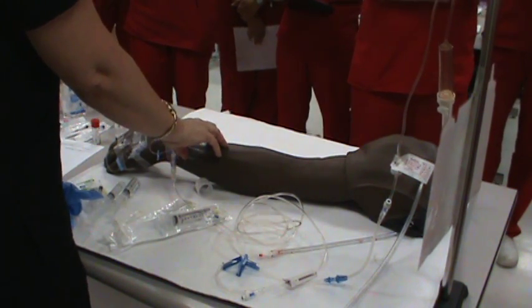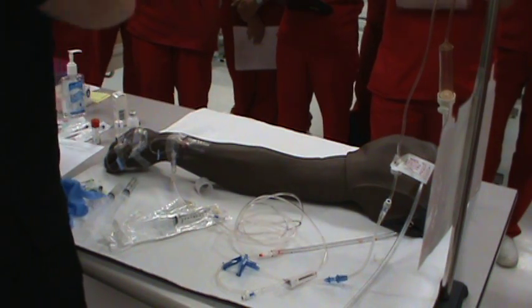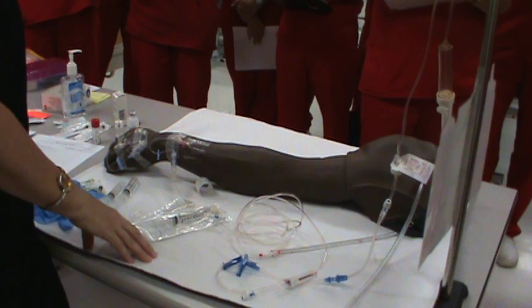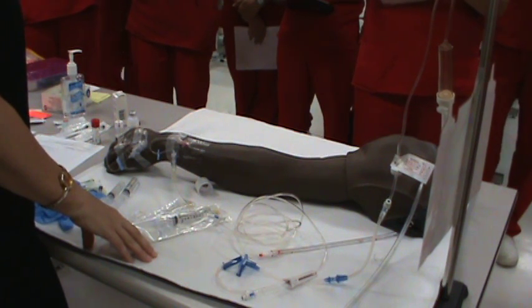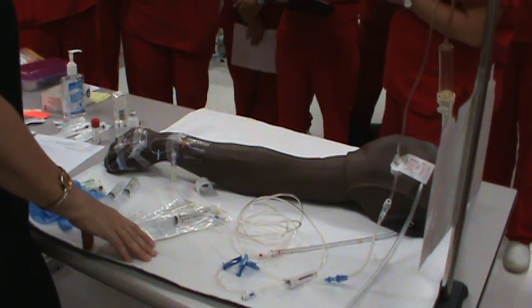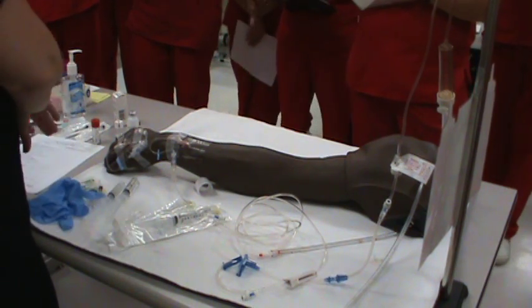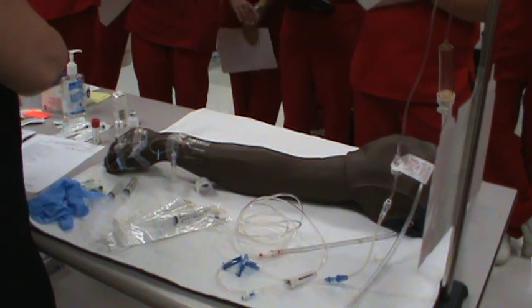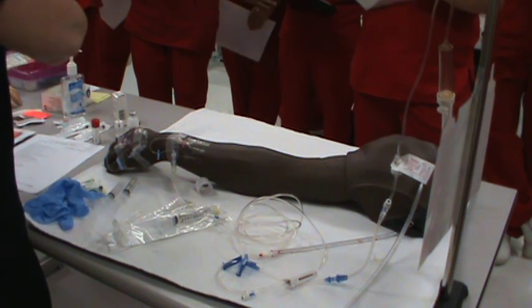I have a question. Yes, ma'am. So if it's supposed to be like 1 mL per minute, would you push it and then wait a minute, or do it slowly over the minute? I find it easiest to push it, wait a minute, watch, okay.